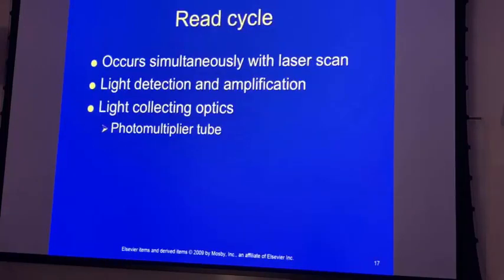Y'all know the difference between a latent image and a manifest image, right? Okay, so a manifest image being the image when? As soon as you capture. How does the process one? What's that? Or is it the finished one?